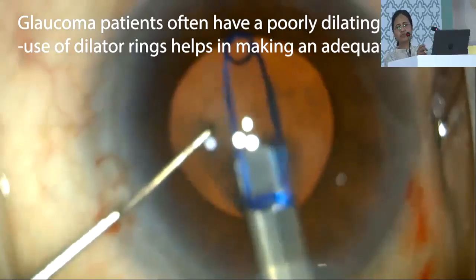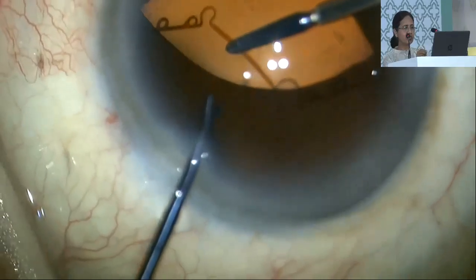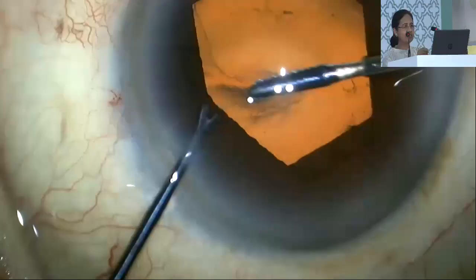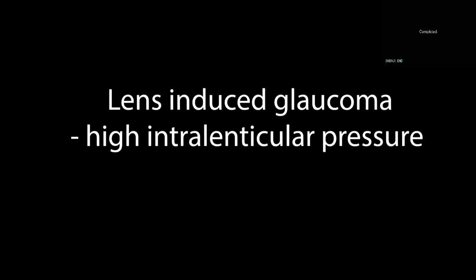Now, in glaucoma patients usually the pupil doesn't dilate, so you can use a pupil dilator ring. Here I'm showing a Malugin ring being used. This ring is like a safety pin, and it dilates the pupil up to 6 mm. It's very easy to use. Now this is a BHEX ring, our very own Indian BHEX ring. This is also very good, and it makes the pupil hexagonal, while the Malugin ring gives a round pupil. This is also useful in glaucoma patients to dilate the pupil while doing a rhexis. So you can see the ease of doing.